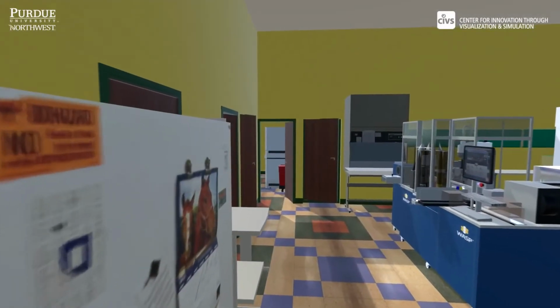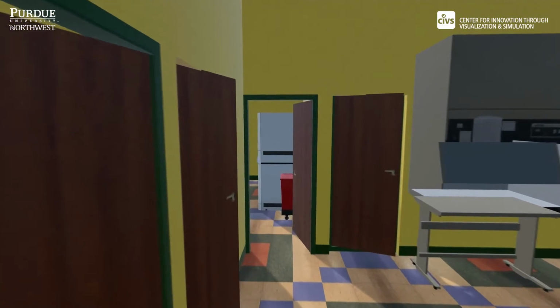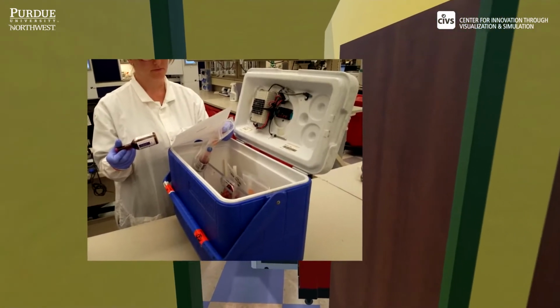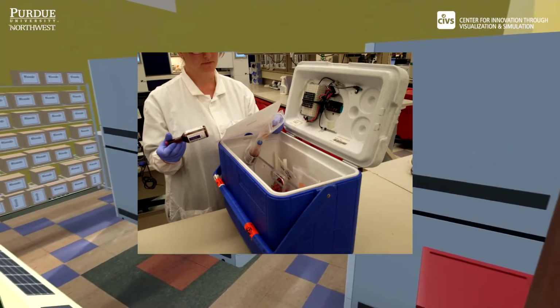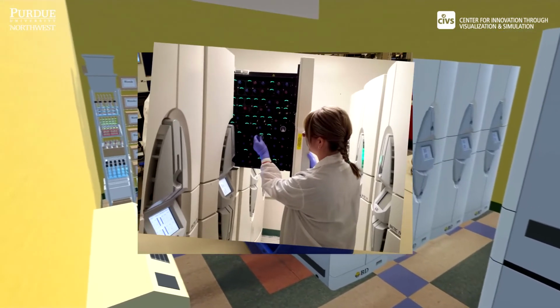The availability of this breakthrough technology prompted us to centralize blood cultures from the hospital sites to the central laboratory. Samples are transported inside custom incubated transports and placed on one of 12 Bactec FX units. On any given day, there are an average of 4,000 blood culture samples in process.